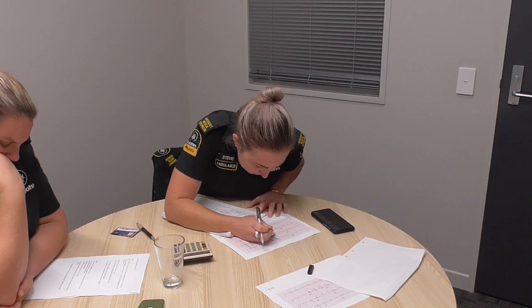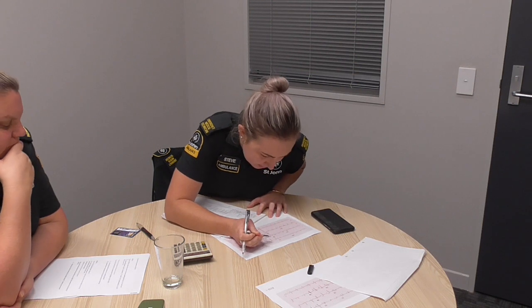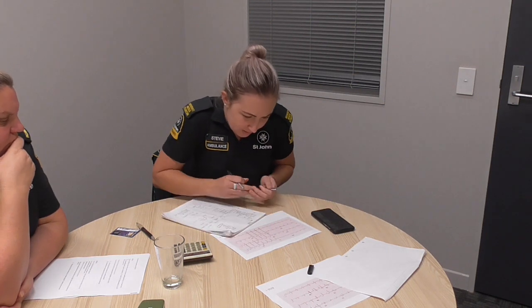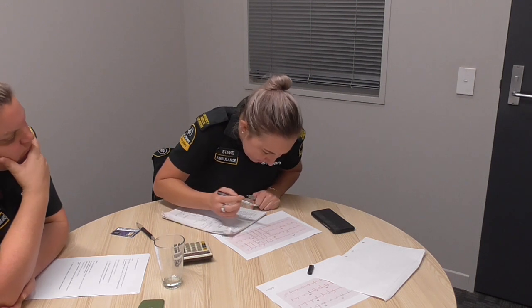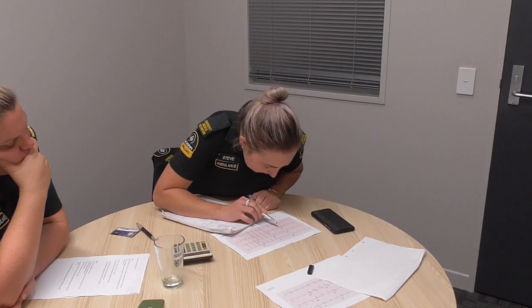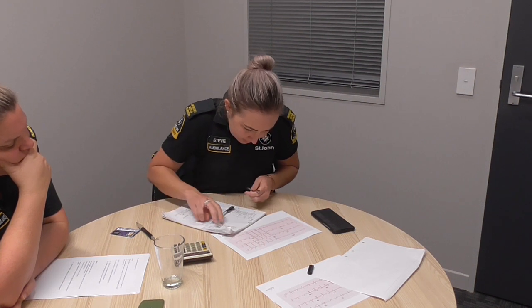We do have P waves present in every lead. Well, you can't see them everywhere, but they will be there hiding. They're upright and uniform. No funny shapes there.